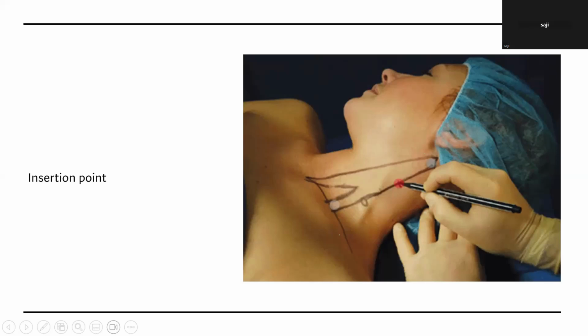The other thing is about the mandibular nerve block. I usually do the oral one, but sometimes there will be trismus and there will be little difficulty. But this block, to give it in an awake patient, will they tolerate that? The track has the parotid and the facial nerve all going close by. I've never done it, but it sounds very good with the PNS. So some thoughts on these two things: concentration of local anesthetic in scalp blocks, and the mandibular nerve PNS approach, the condyle route.